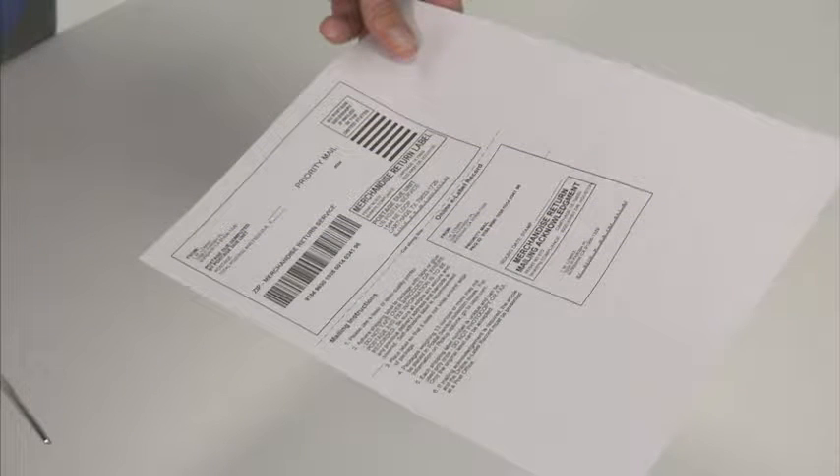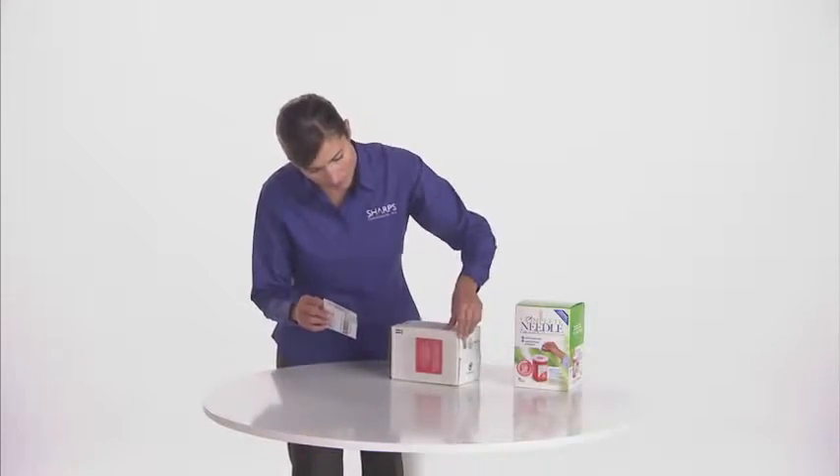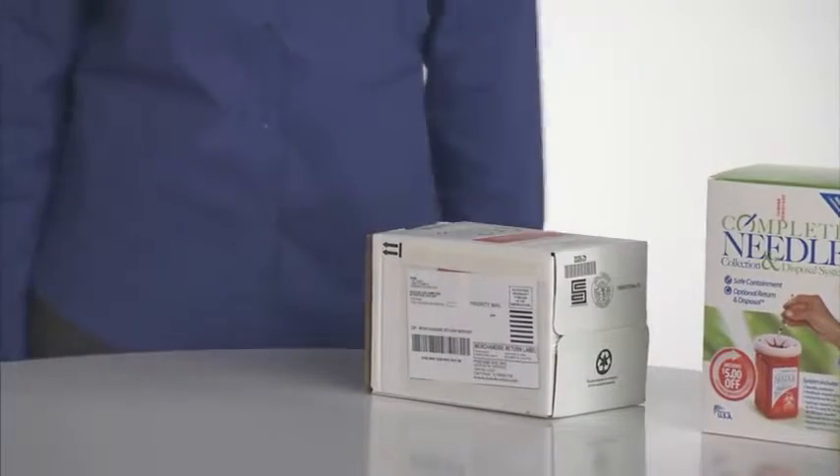Once received, you simply print it and it's ready to use. Once you have printed or received your return mailing label, simply cut it out and place it — barcode facing out — in the plastic pouch located over the red label on the side of your return box.